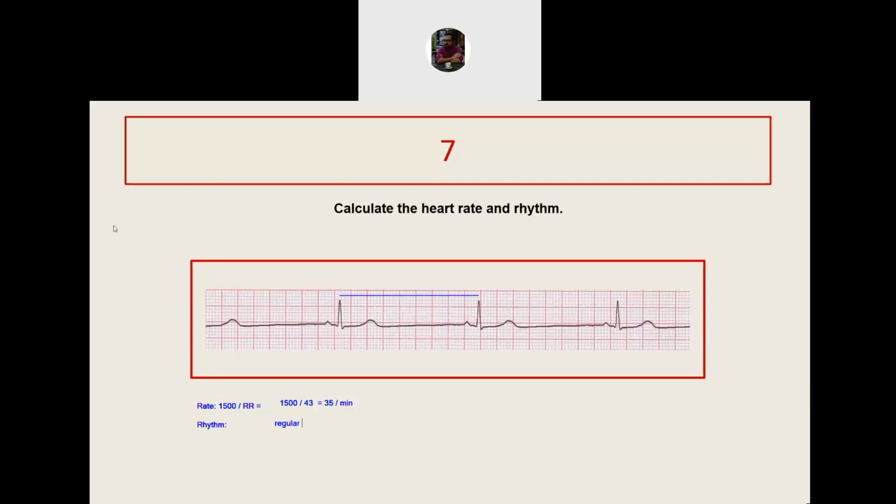So you can easily count 43 like this. Each large box that you see here is 5. So we have 7 such boxes, that is 35. Then you count the small boxes: 36, 37, 38, 39. And here it's 40, 41, 42, 43. So I hope this is clear to everyone.